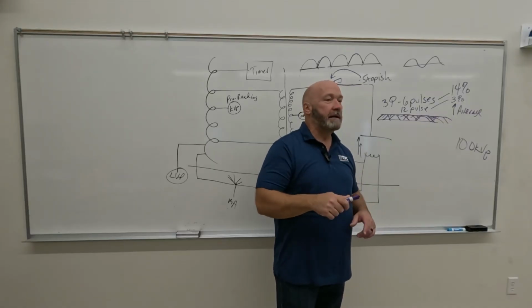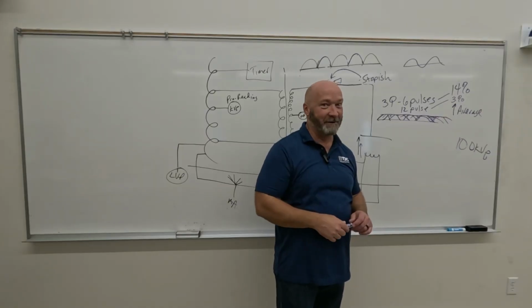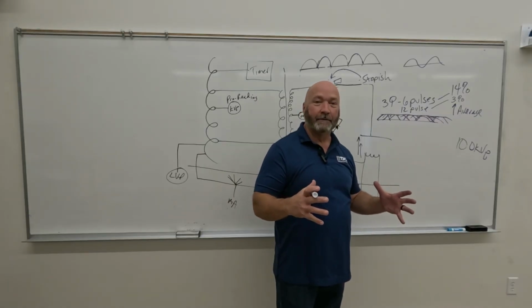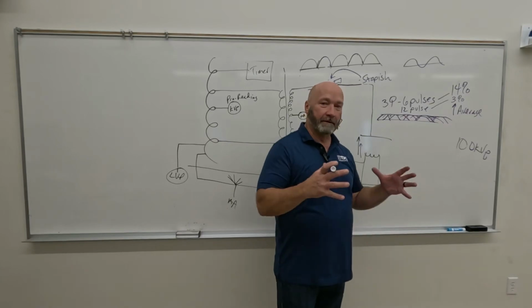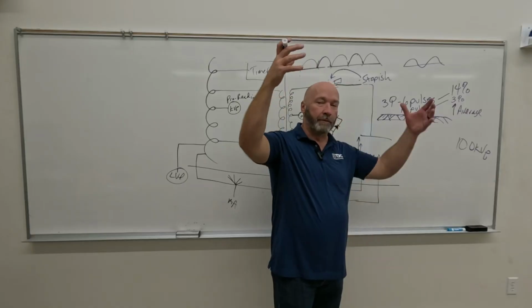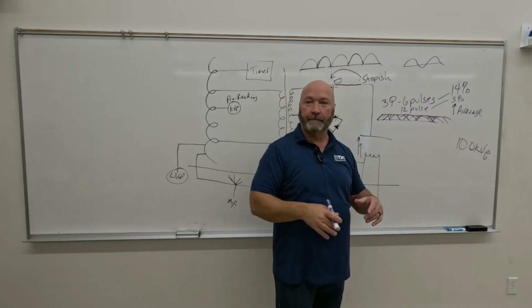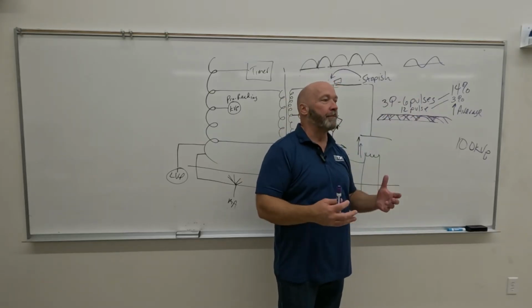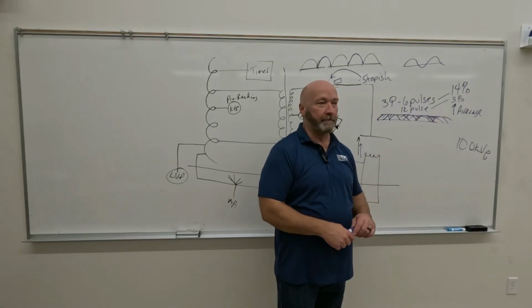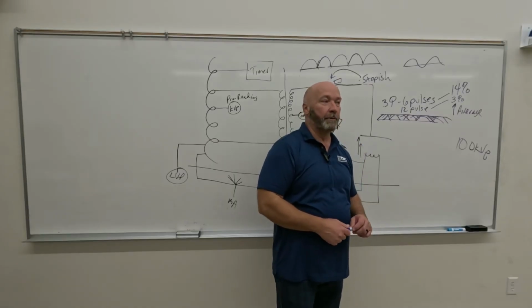Inside that box is a thing that's about the size of a 2.5 gallon paint can. That's your generator. That's your high voltage transformer. In that little bitty thing, where they used to be massive, they're tiny now. And they can put those in a false ceiling, or inside the overhead crane system. The footprint is so small on a high frequency transformer, high frequency generator, that they can put them anywhere. They can go inside the X-ray unit itself. So pretty wild, pretty wild.